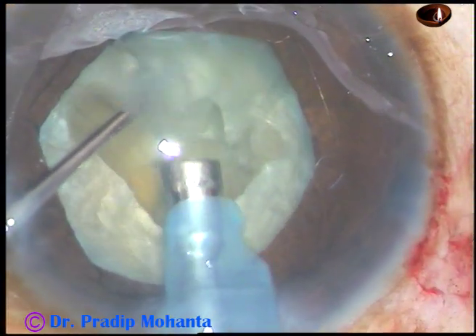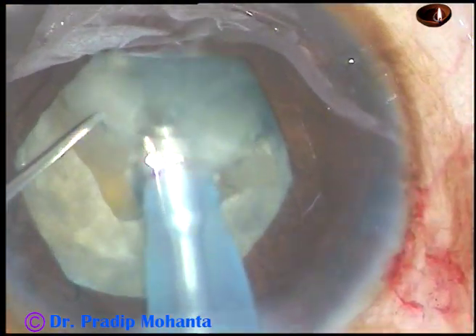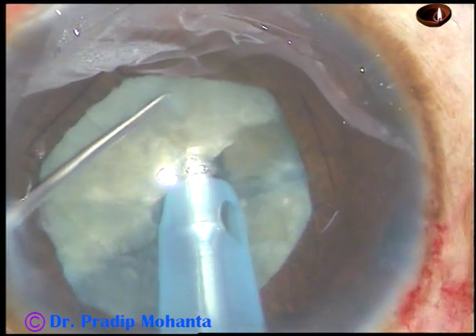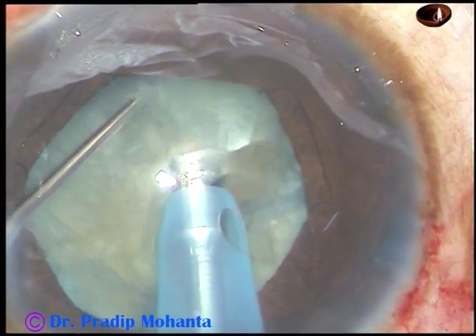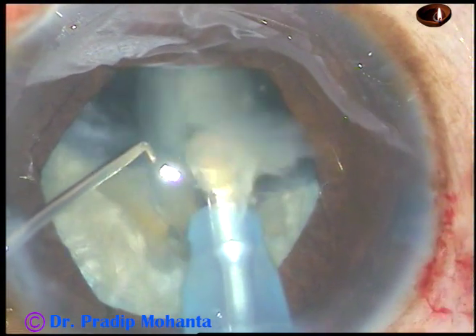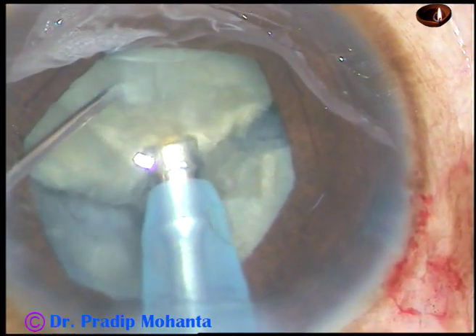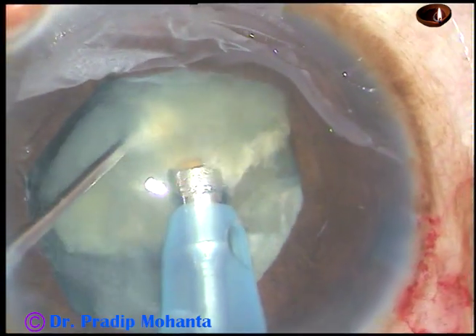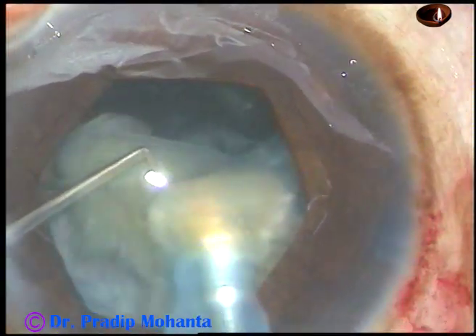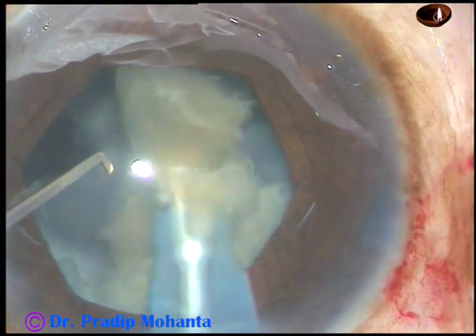Now these free nuclear fragments can be emulsified right now because the cataract is not very hard and you are in control. See again — the chopper goes really deep into the nuclear mass. Don't be in a hurry and don't just scratch the nuclear mass. Go into the nucleus — at least 60% depth — and then apply opposite forces. In this way, divide the nucleus into several fragments and emulsify each fragment. You can make a fragment free and emulsify it at that time itself.